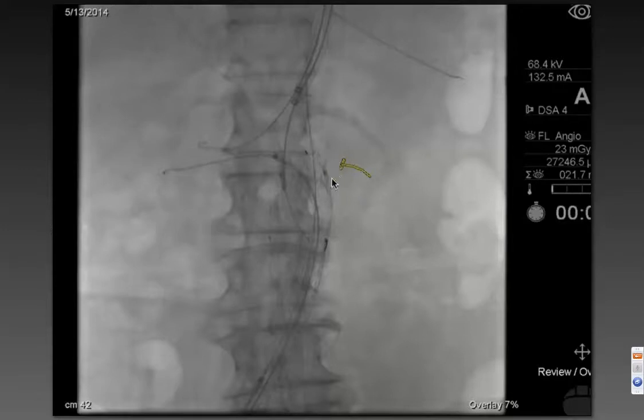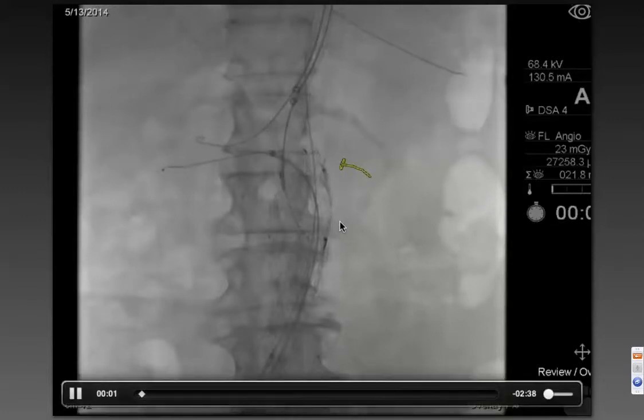In this case, it was the left renal because we're having to come up and over the top of the endograft. As you know, you can often do this with a reverse curve catheter, but you may or may not be able to get a sheath to track over the top of this device, because that can be particularly challenging.